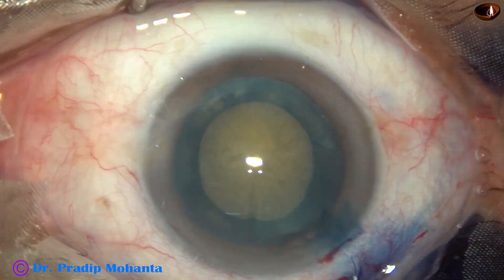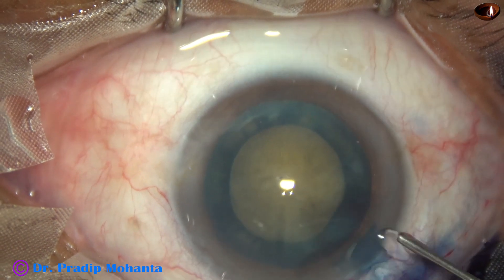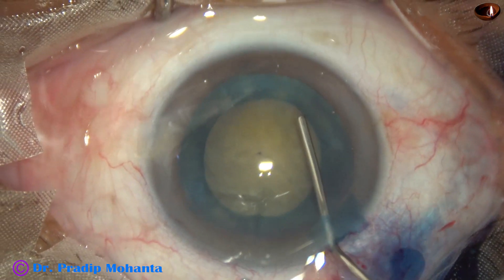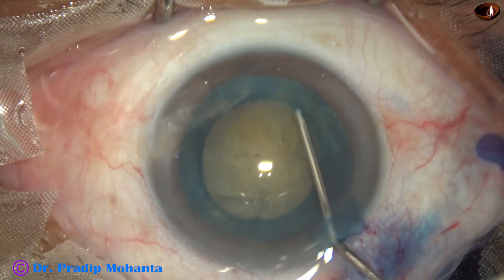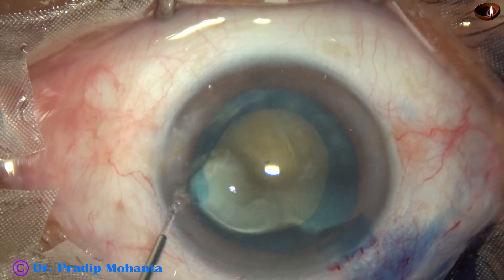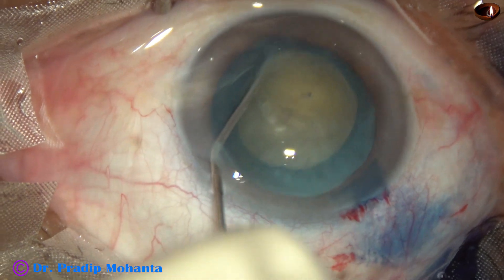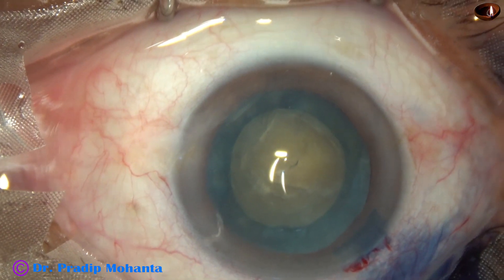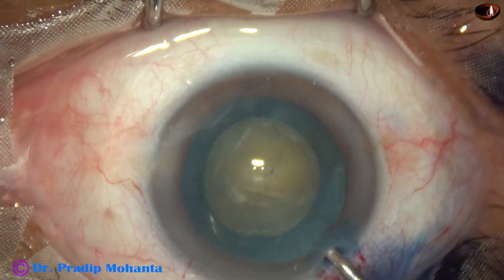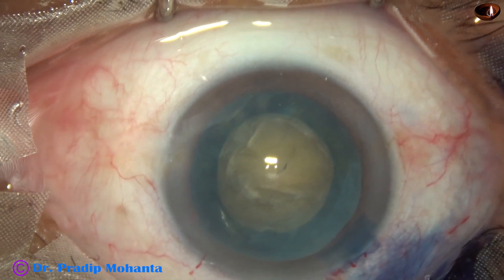This rhexis is small — it may be 4.75mm or 5mm. I didn't want to do a large rhexis in this case, though the cataract is quite hard. Because if I go to the periphery, I have to tear off more zonular fibers, and it can cause zonular dehiscence.